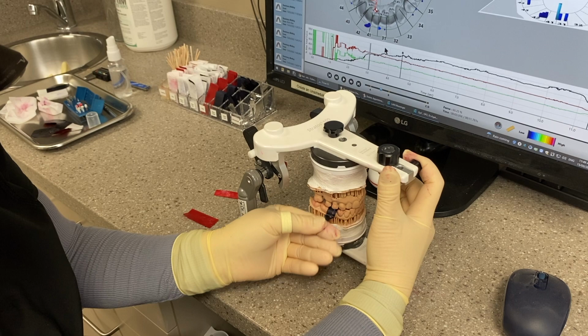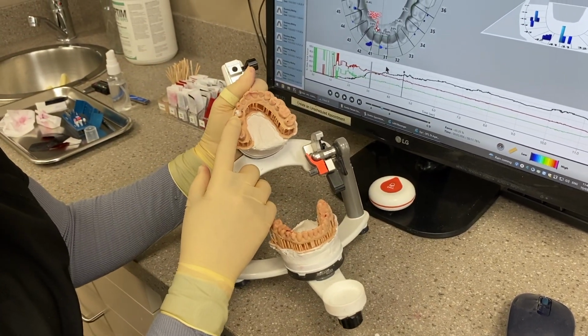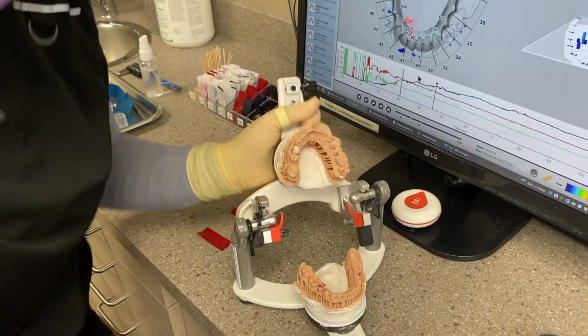And that's right on the bicuspid. So it's marking on the palatal cusp. So again, this tooth could be adjusted. I'm going to adjust this one because we're already covering it up with some sort of porcelain restoration.